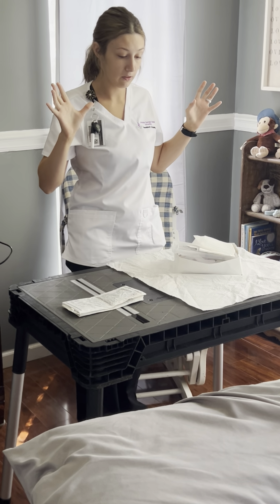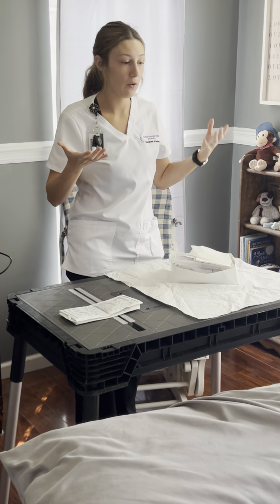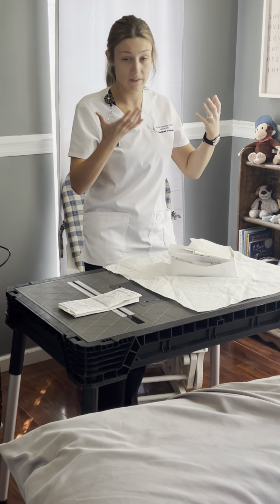If this was a hospital setting, I would have the table adjusted to comfortable working level, and I would also have the bed adjusted to more of a comfortable working level, elevated.